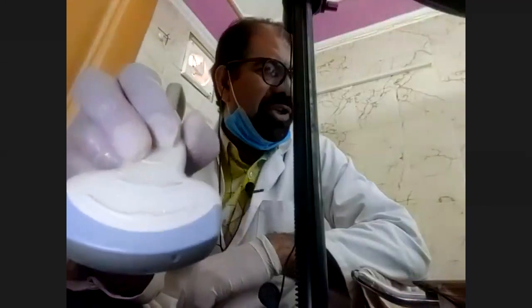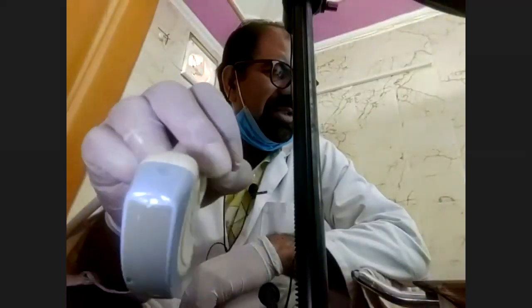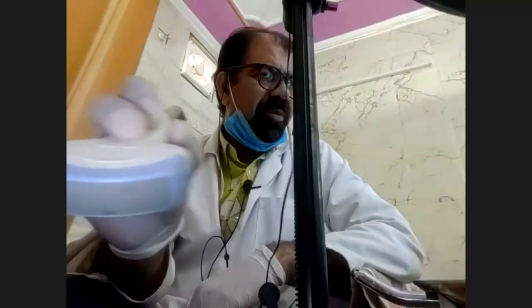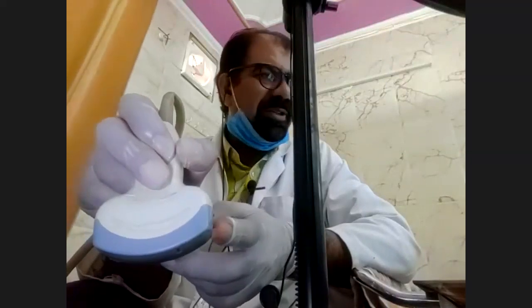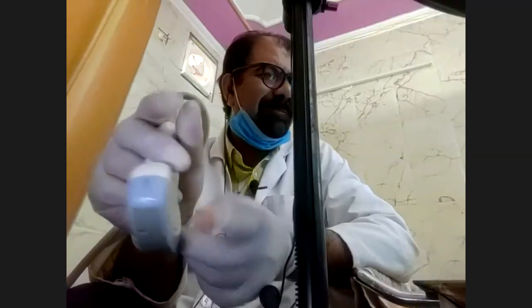Now the rotation from transverse section to longitudinal section is like this. Another question: if I am putting the probe like this and this indicator is towards the right of the patient, this indicator should move upside.